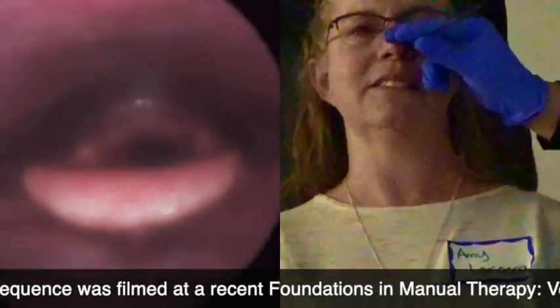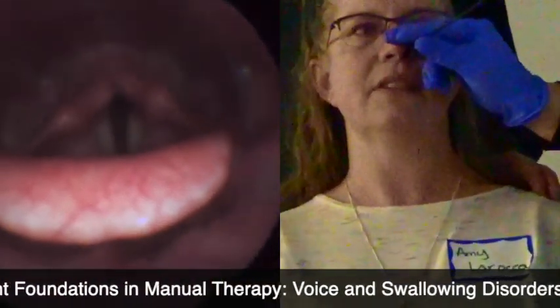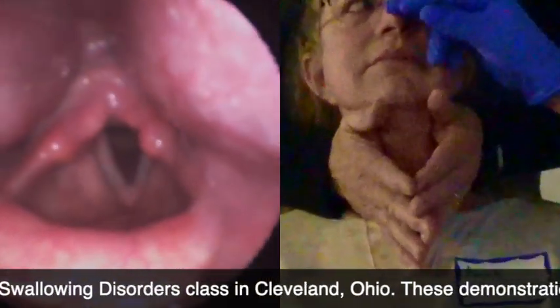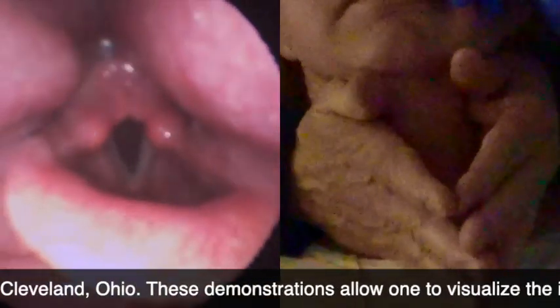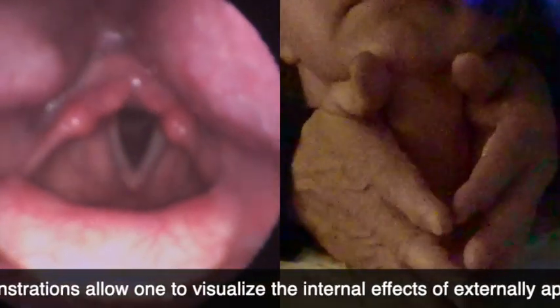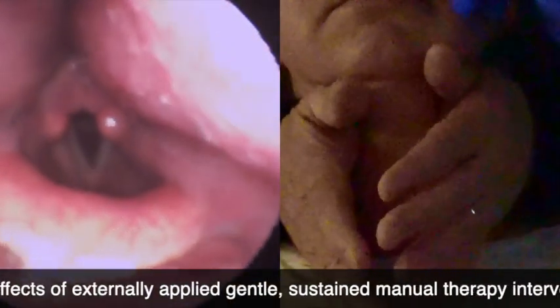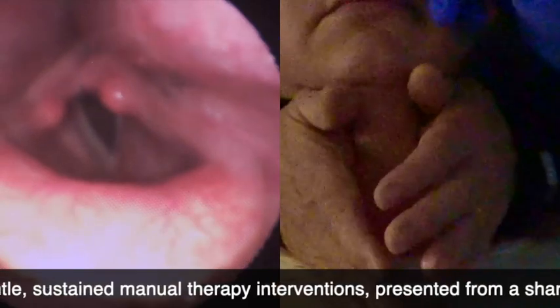So primarily what I'm going to be doing is what we did already this morning, what we're going to do next, and what we're going to finish the day with. As I work my way up that right wall, and that's imaged on the left, correct? Yeah, so it's opposite. Closest to us would be her right side, closest to the door is her left. Here I go, working my way up and down on the right side, what you might view as the non-affected side. Now let's go in on that left side, and boy, that's kind of lumpy, grumpy right there.